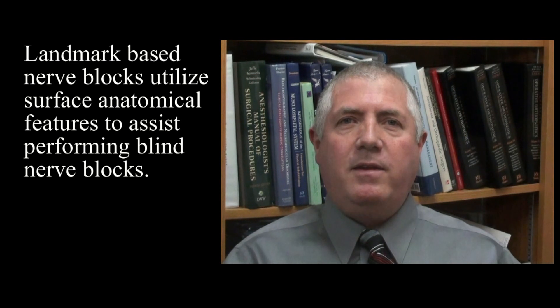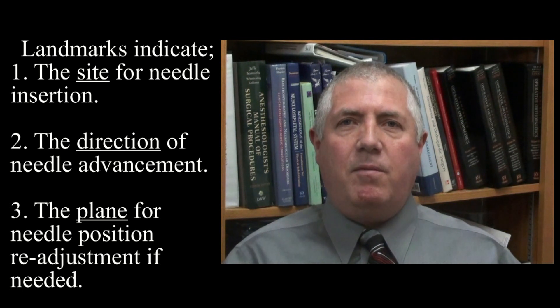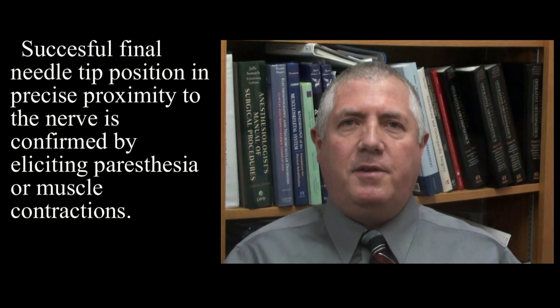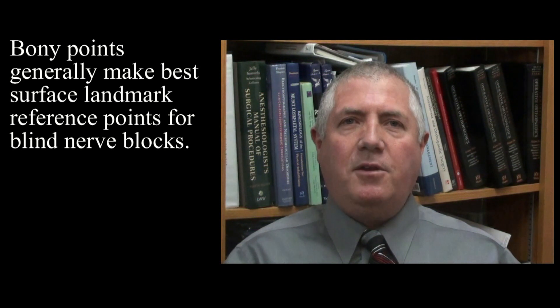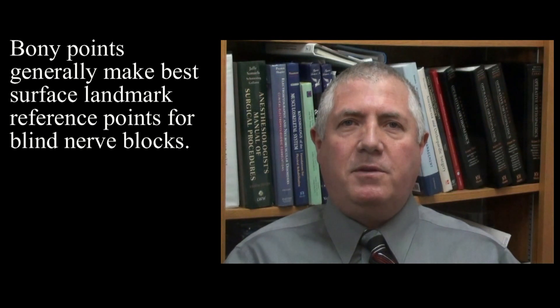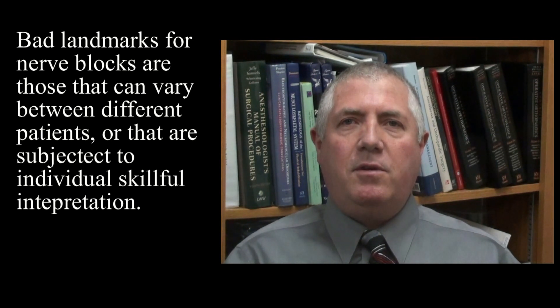Landmark-based nerve blocks are blind techniques that utilize surface anatomy to identify the position to insert the needle, the direction to advance the needle, and the plane within which to redirect the needle if needed. Successful final needle tip position is then confirmed by elicitation of paresthesia or muscle contractions. Best landmark-based nerve block techniques rely as much as possible on fixed bony reference points that are consistent in position between all patients. One should avoid landmarks that are subject to inter-individual variation or to uncertain interpretation.